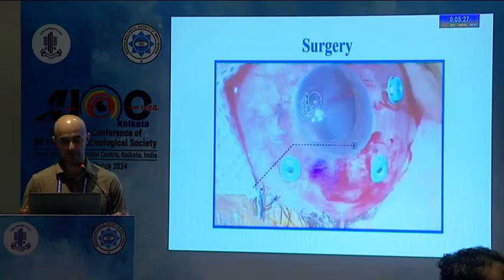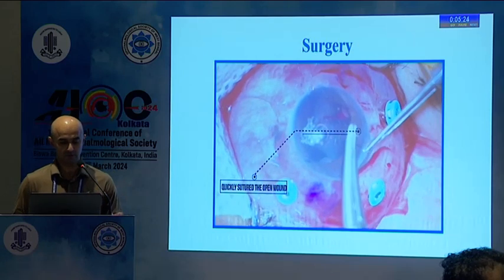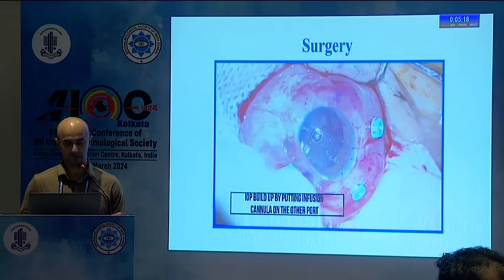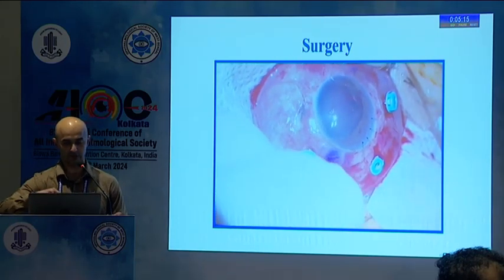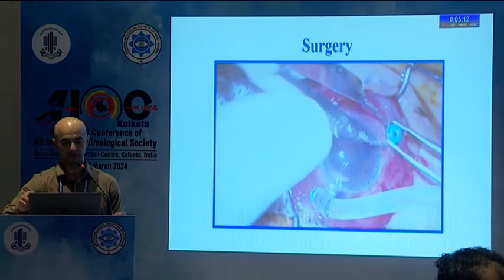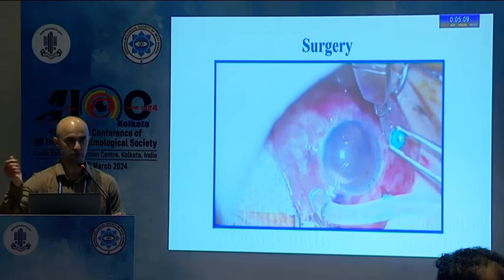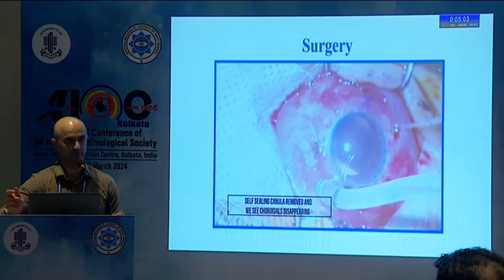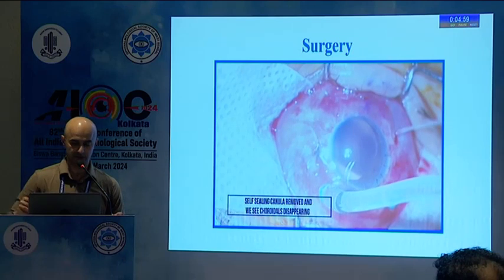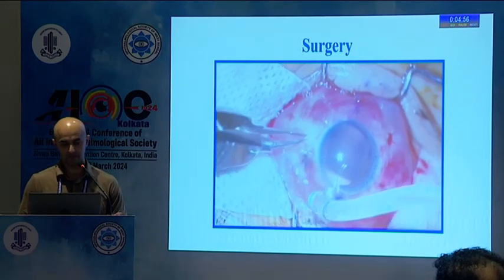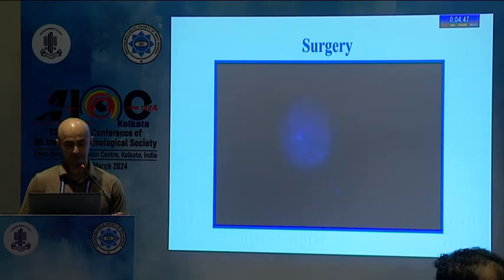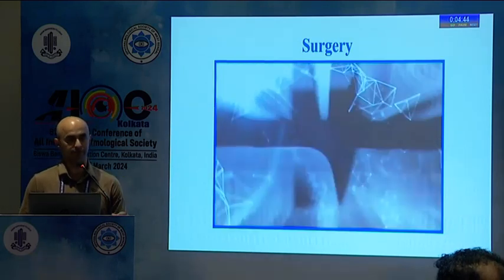All that you need to do here is stop, take the cannula out, and suture the wound. Then start the infusion from the other side. I can see the inferotemporal choroidal effusion. I've started the infusion on the nasal side and all that's needed is removal of these valved cannulas — the valved cannulas do not allow drainage of choroidal effusion. You can see that removal of this cannula allowed the patient to settle, and then the surgery can be performed with secondary IOL fixation. Using the endoilluminator, I'm confirming everything is okay inside with no peripheral effusion.